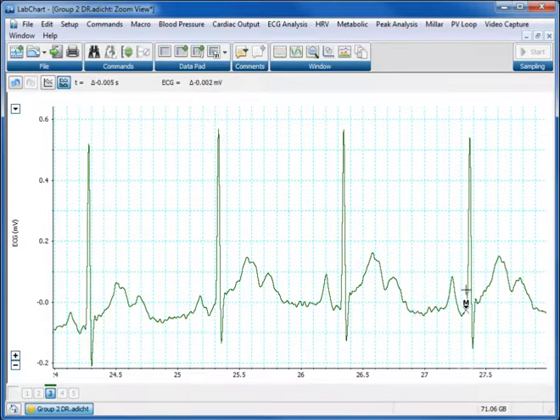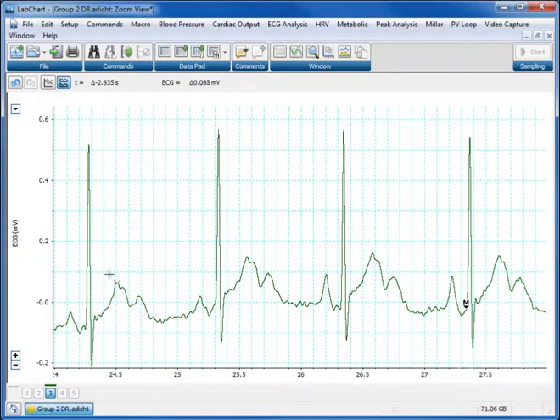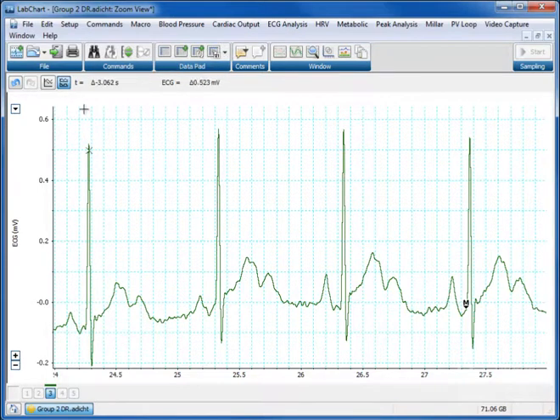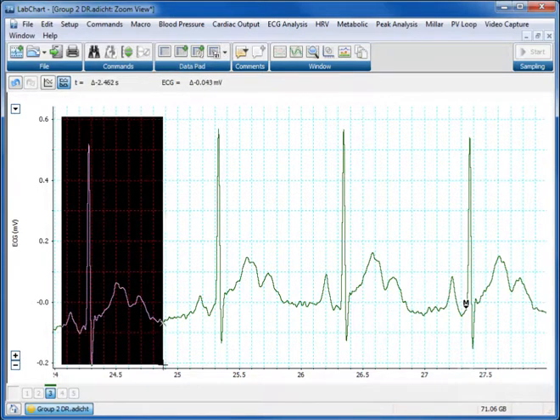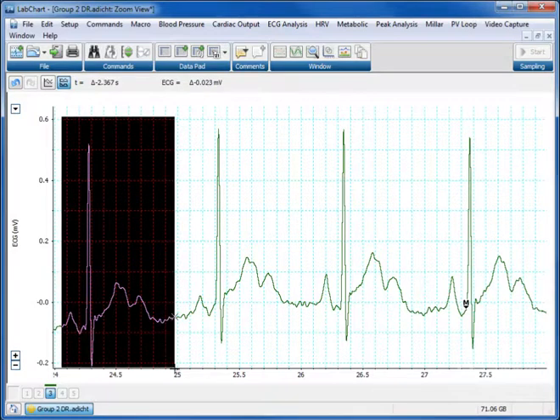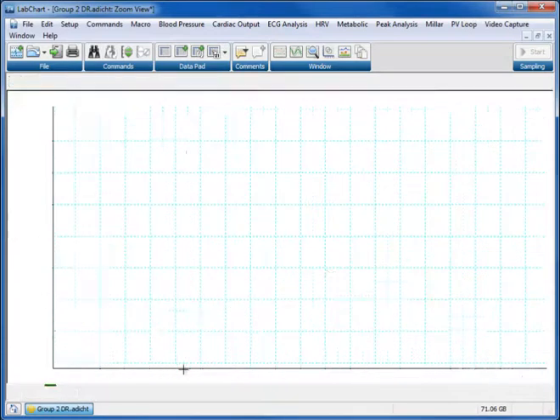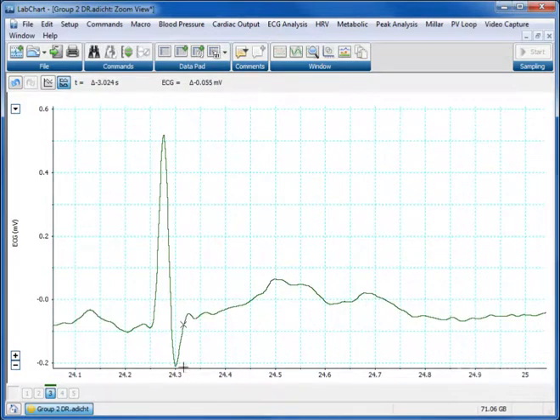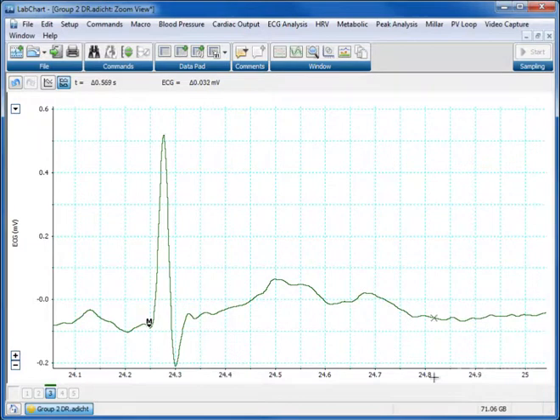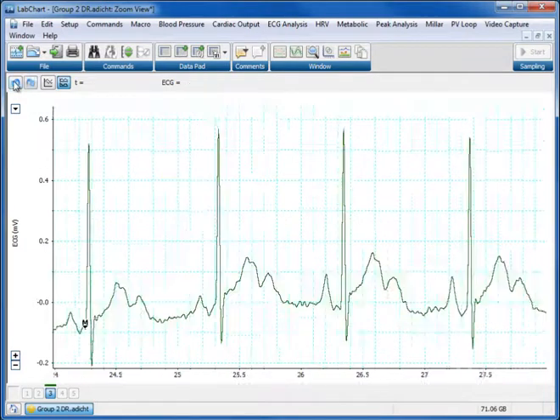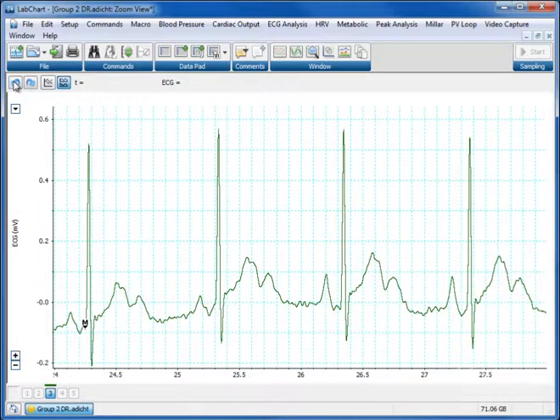You can see it's very easy to do accurate measurements and if you are not sure about how accurate you're going to be, you could actually highlight each of your traces individually and redrop the M onto Q and go to the end of the T and you can write them down that way. You can't scroll using this window, it only goes where you were, so you can go undo and go back or you can redo and go back forwards again.